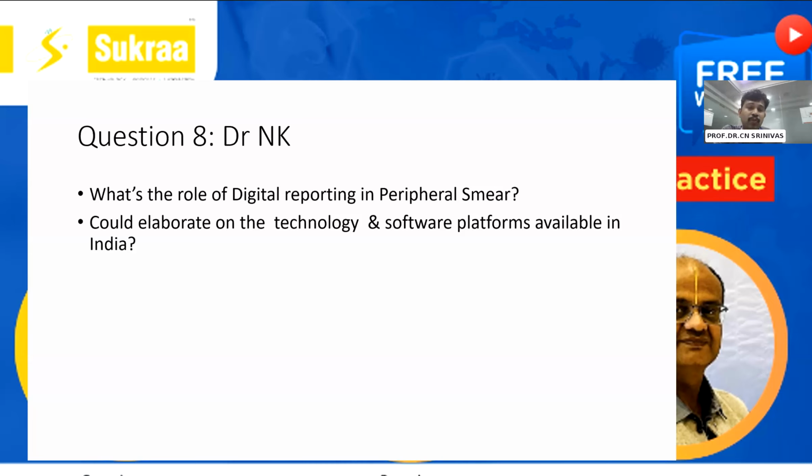This will be a very good value add in high volume centers, specifically those low on resources, which have to screen through a lot of slides before giving a valuable report. Not only that, sometimes remote areas require a specialist contribution. If these systems are installed, the slides can be scanned and sent for a second opinion to a specialist who is elsewhere.